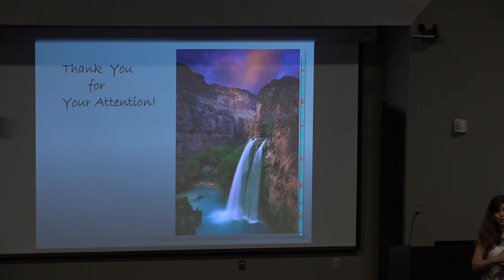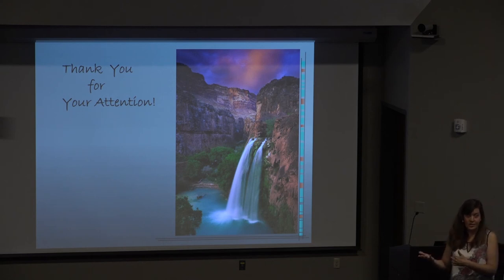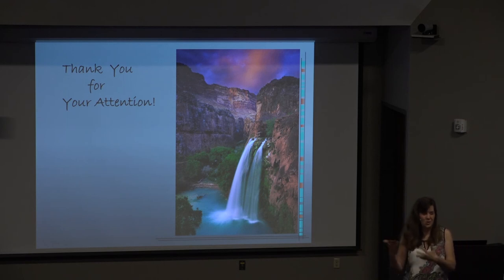And then before 32 weeks, the placenta is more homogeneous. So if you see this stuff before 32 weeks, your level of suspicion is higher. After 32 weeks, it's naturally more heterogeneous and more lobular, and so you could be overcalling a lot, particularly the accreta and increta parts.